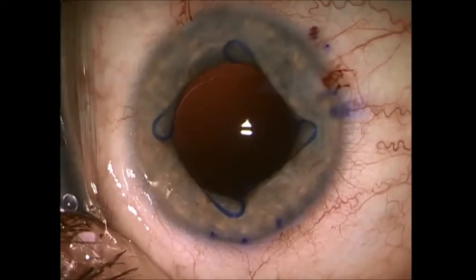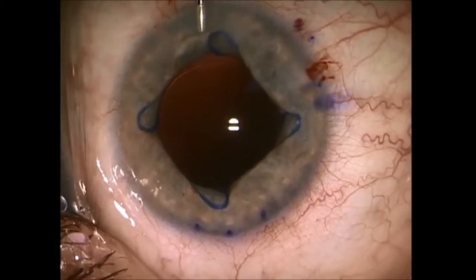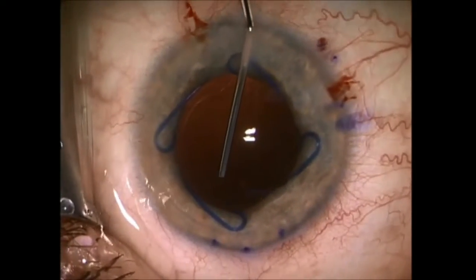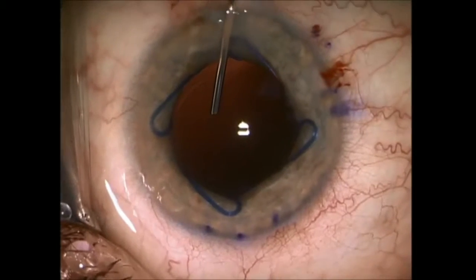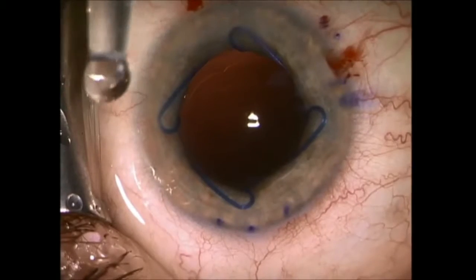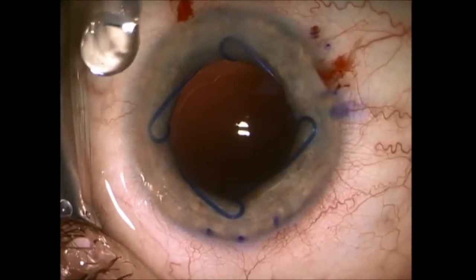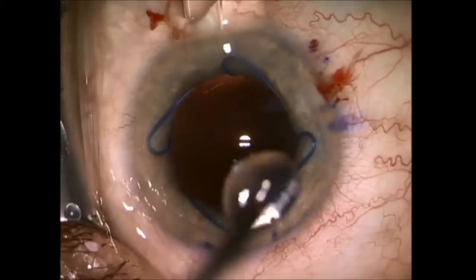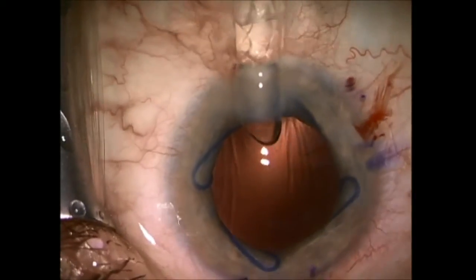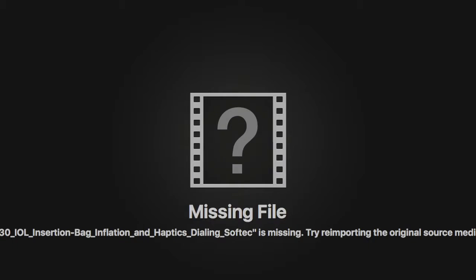Whenever a Malyugin ring is used, the insertion of an implant can be just a little trickier. Make sure you put adequate OVD, or ophthalmic viscoelastic device, to inflate the bag and coat the scrolls of the Malyugin ring to prevent any damage or scratching of the implant. Then insert the implant like you normally would, delivering the distal haptic right into the bag, and then tuck the proximal haptic into the bag.